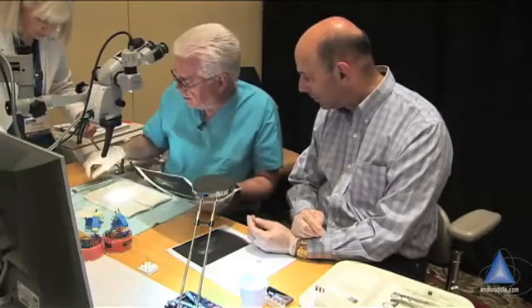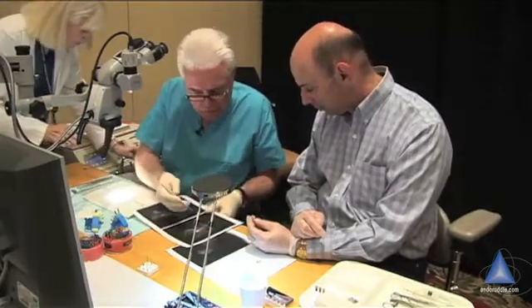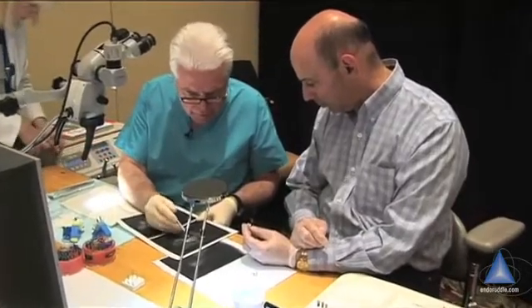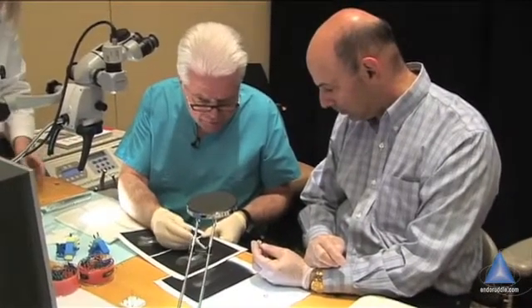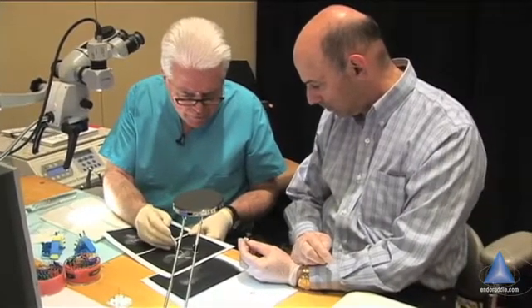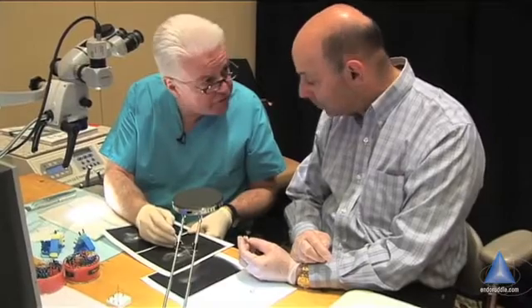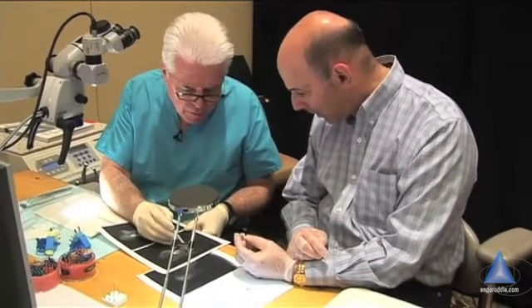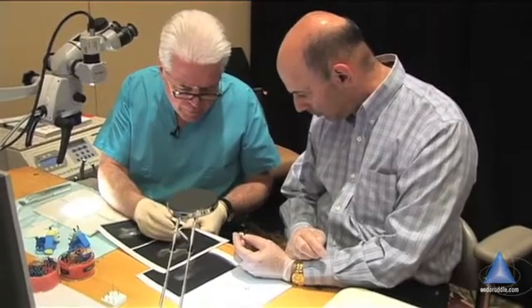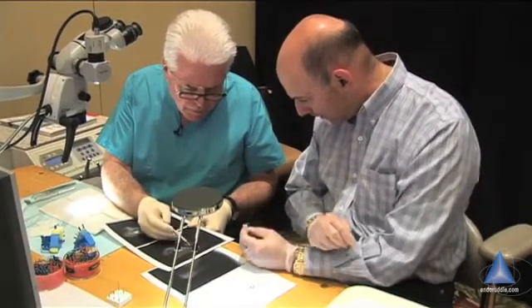If you start to plan and you're looking at this like we talked about in the lecture, I'm looking at the upper half of this root, and I'm noticing that I could improve my access in the coronal part — get a little more access here. We could probably get down to about right here and pre-enlarge this aspect of the canal, which I think I've already done.